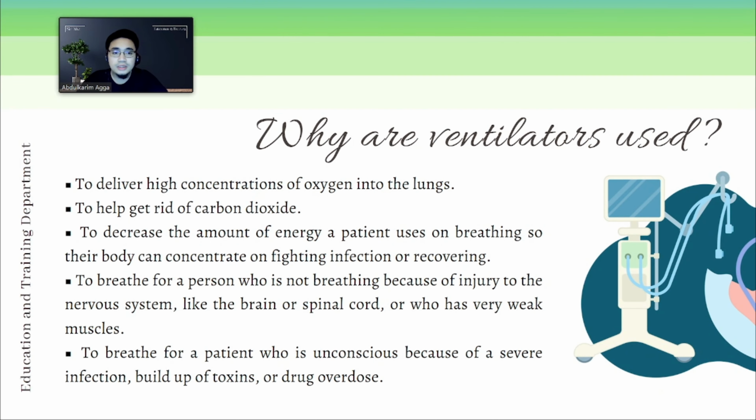Okay, so why are ventilators used? Again, as we have discussed a while ago, ventilators are used to deliver high concentrations of oxygen into the lungs, especially for patients who are experiencing increased levels of CO2 due to medical conditions in their body.